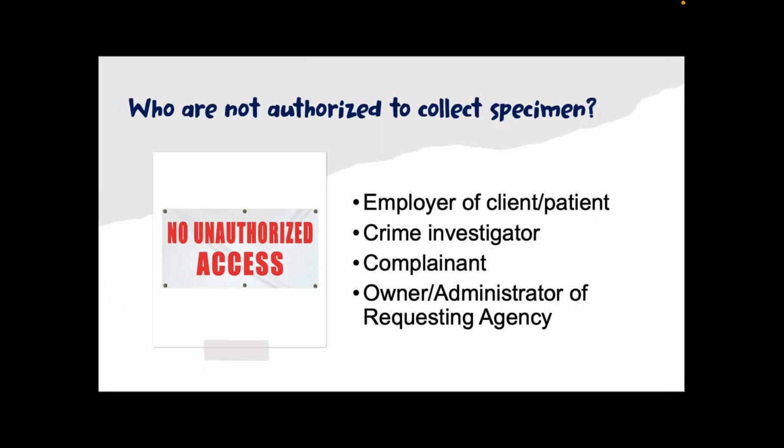Now, who are not authorized to collect specimen for drug testing? We have the employer of the client, patient or donor, crime investigator, complainant, and owner or administrator of the requesting agency. Even medical technologists who are employed in a laboratory also undergo drug testing from time to time as part of their physical examination, for example. But for them, they also need to choose a different laboratory for testing.